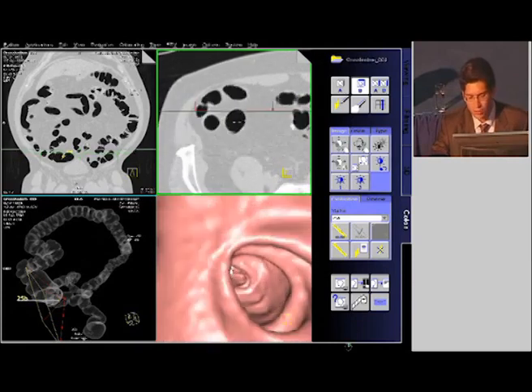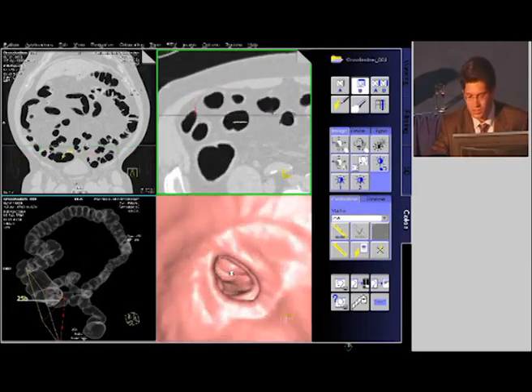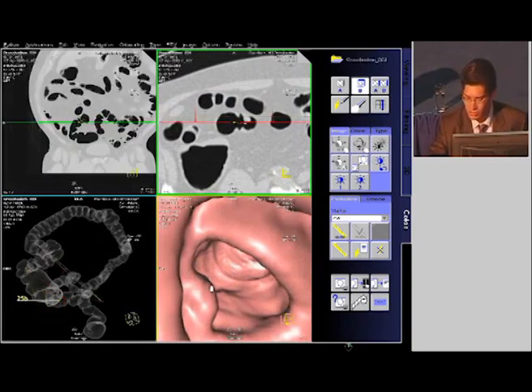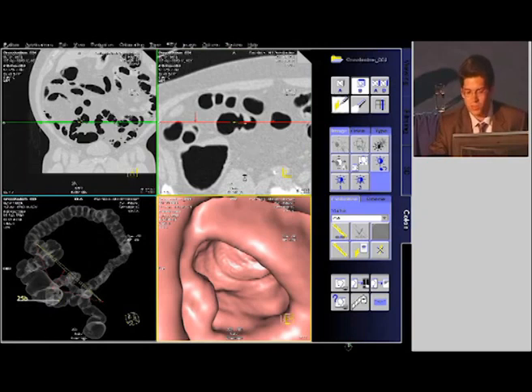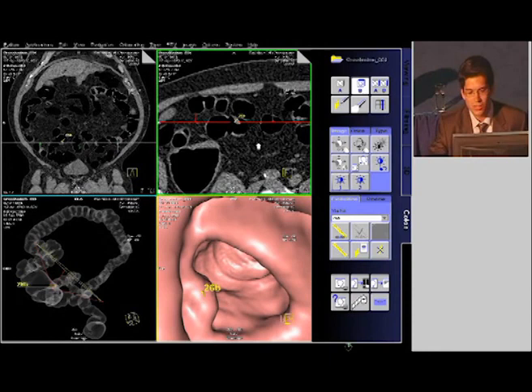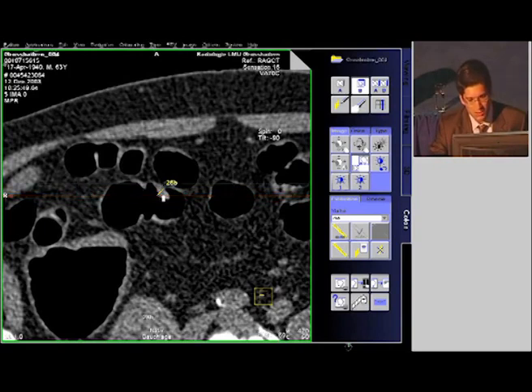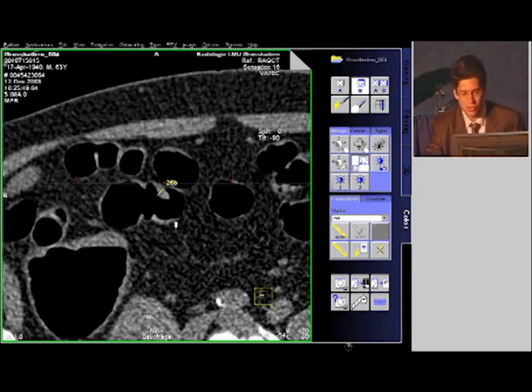The colon, although it is not too well distended, is nicely prepared. You can see there's another large lesion sitting at the right-hand wall of the colon. Just put a lesion marker on it, and you can display this image in soft tissue window. You're easily going to see that this is a soft tissue mass. In the lower right corner you're going to see the attenuation of that mass — if I put my cursor in here, it shows about 65 Hounsfield units, which is indeed a soft tissue mass.